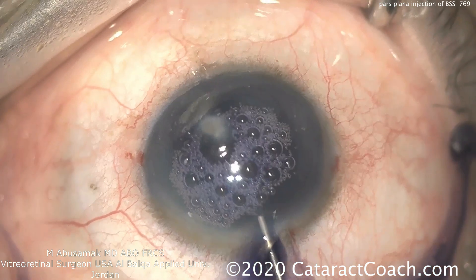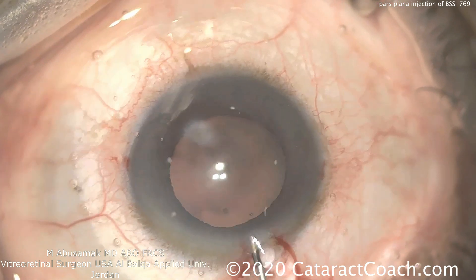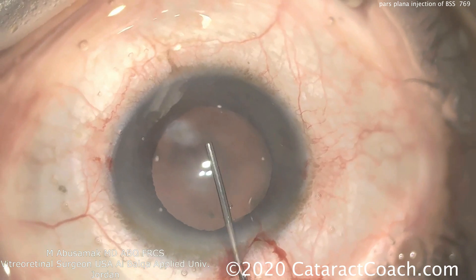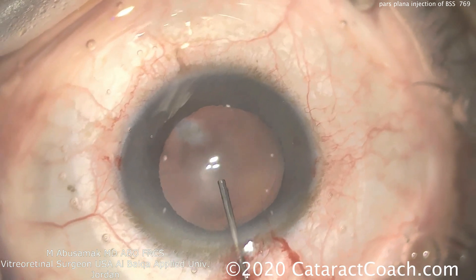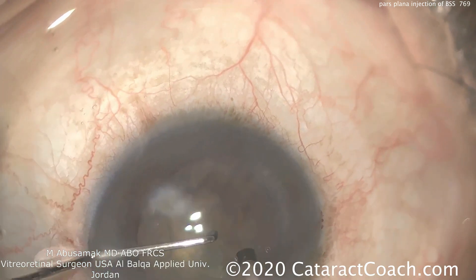A little bit of TriPan Blue dye is being used to stain the lens capsule. The TriPan Blue dye also gives a little bit less elasticity to the capsule. So viscoelastic can be put inside the eye. The capsulorrhexis goes beautifully. Now here's the phacoprobe in the eye.